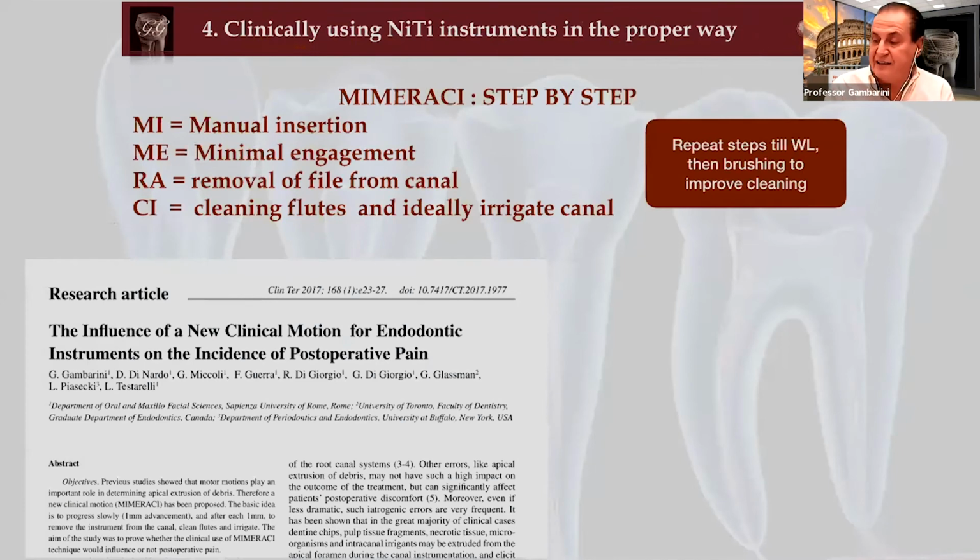But there are also other things you can do. You can use a technique to get into the canal which is a little bit more delicate, and also a little bit safer. Once again, this is a technique we proposed years ago in this article. It's called Mimerachi, and it's a step-by-step technique.